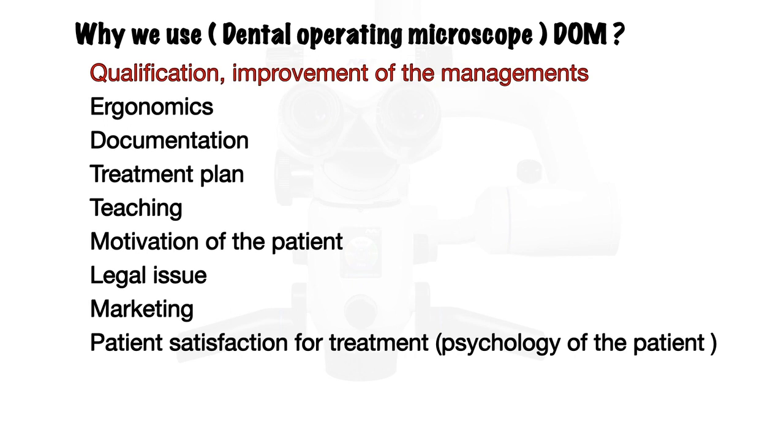This tool, which is a kind of magnification, will improve the quality of my work and my treatment procedures. So improving your management is very important to consider, because if you want to update and upgrade yourself, you should use tools that improve your skill. So let me take an example with you.